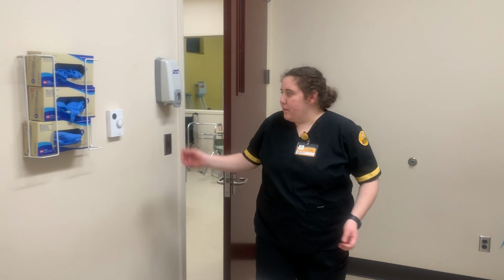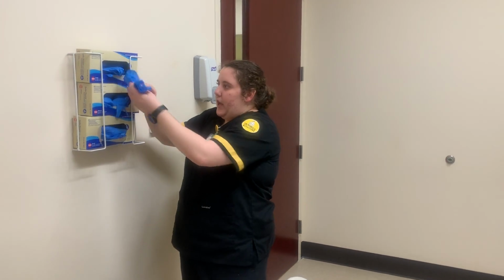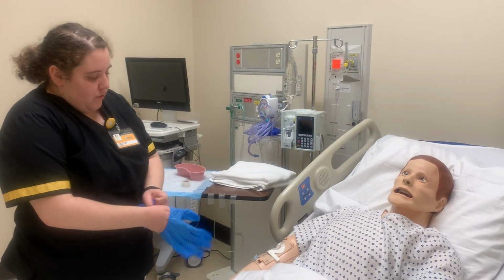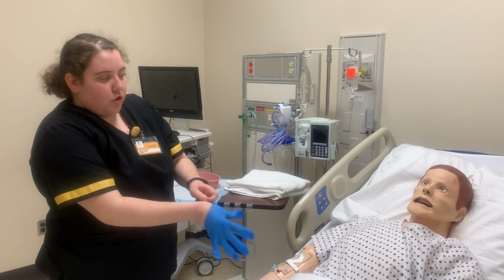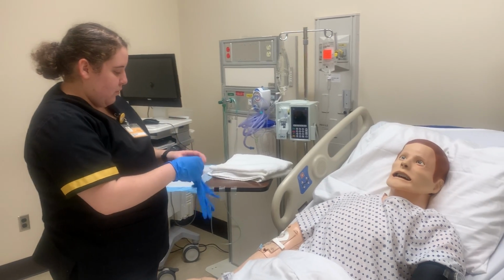Is Alexis. I'm going to be your nurse today. The doctor has put an order in for me to do an NG tube, which is a nasogastric feeding tube that goes down your nose to the back of your throat and into your stomach to help you get necessary nutrients that you are currently not receiving. So while I put these gloves on, can you verify your name and date of birth for me, please?